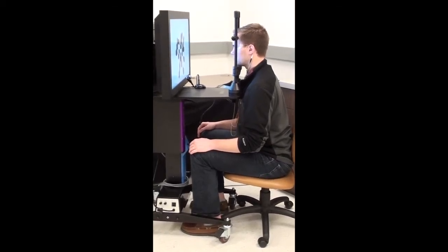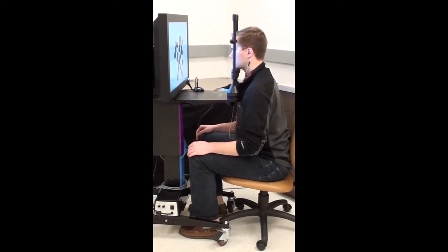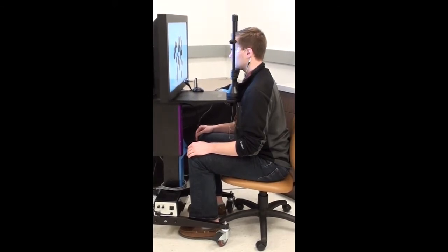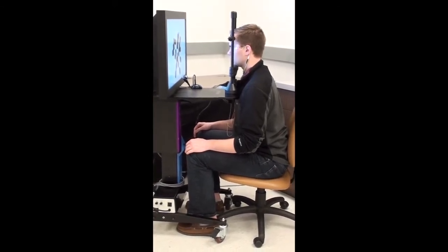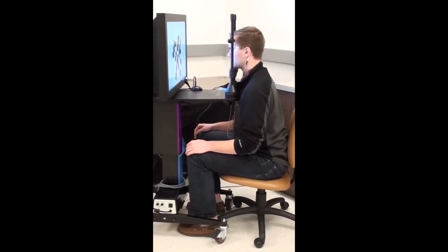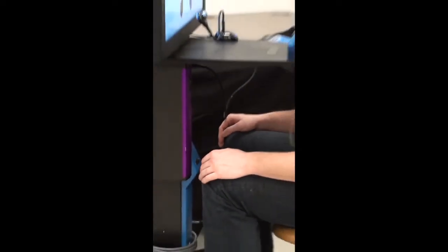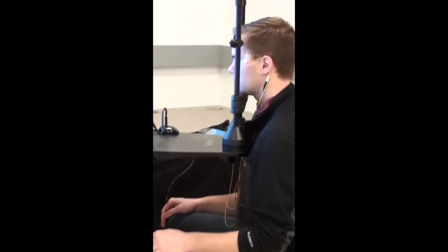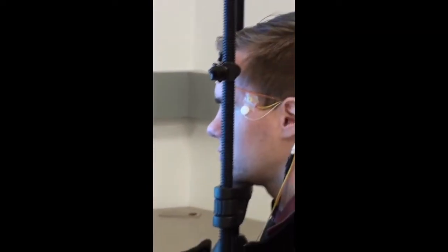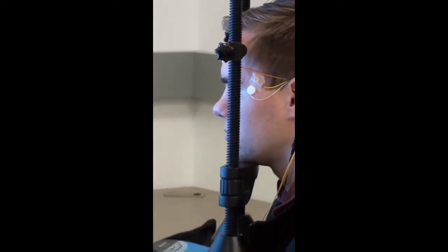When running a multifocal ERG, make sure that your patient is comfortably seated in front of the monitor. You can adjust the height of the table, the chin rest, or the camera.